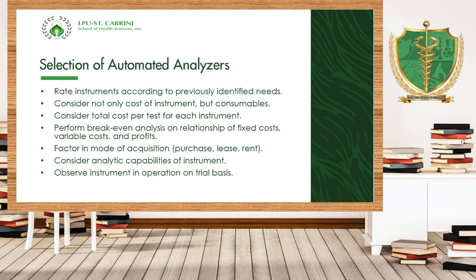So you have to consider first the rate of instrument to the previous identified needs. Do we need to automate FBS? Aba, kung sa panahon ngayon at ang FBS mo ay semi-automated pa din, ay mag-isip na ang laboratoryong pinagpupuntahan mo. Okay? Consider not only the cost of instrument but the consumables.